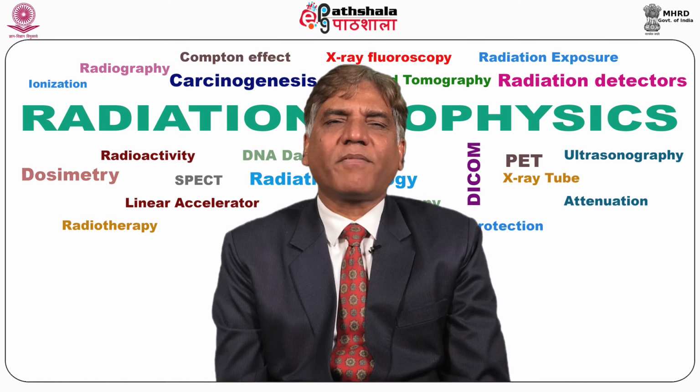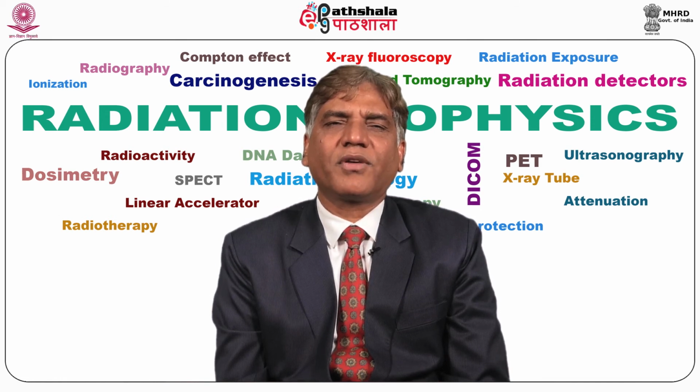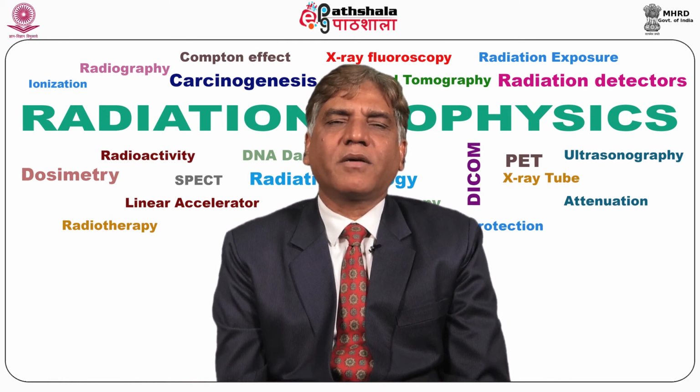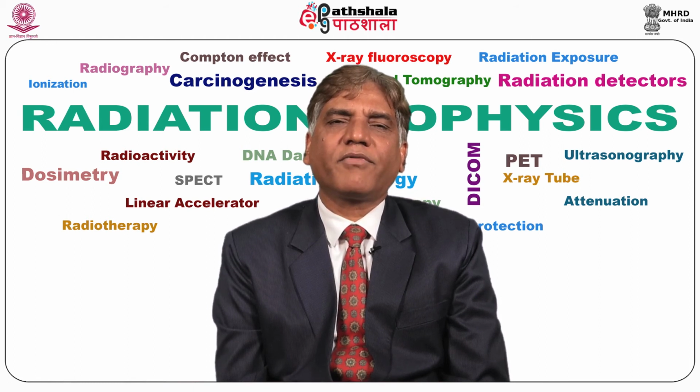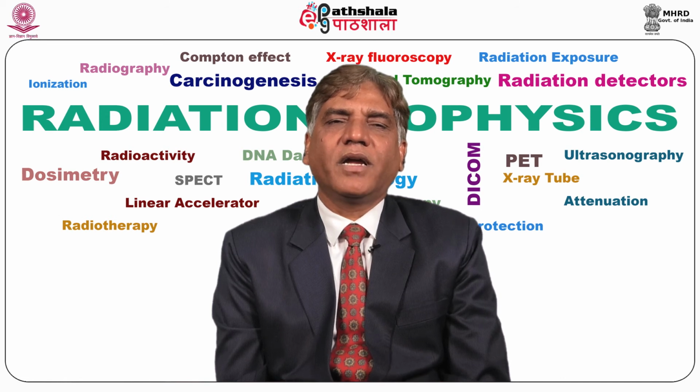To determine the Doppler shift at a specific depth requires that the ultrasound transducer produce a very short duration burst at a precise rate of repetition, known as pulse repetition frequency, which determines the maximum depth from which a Doppler shift can be detected. The advantage of pulse wave Doppler is that it can identify the source of the signal.